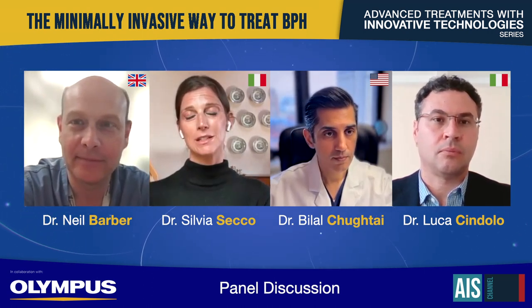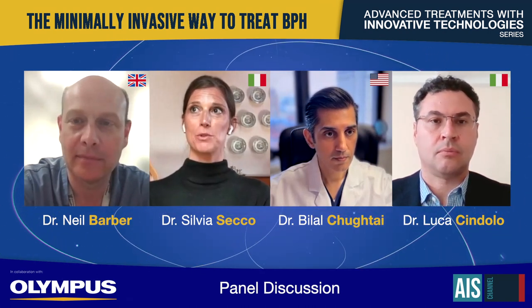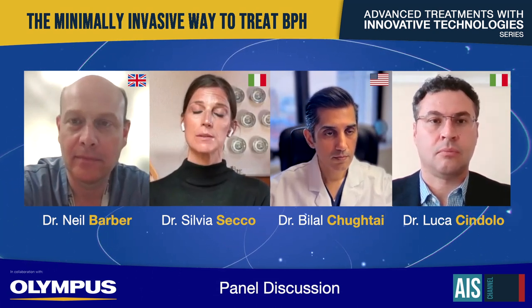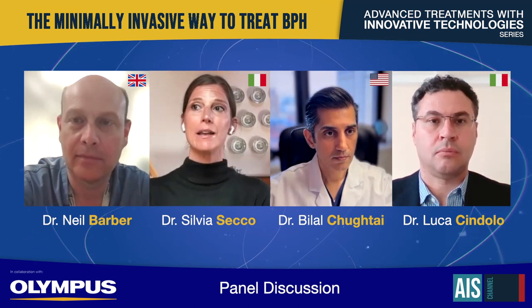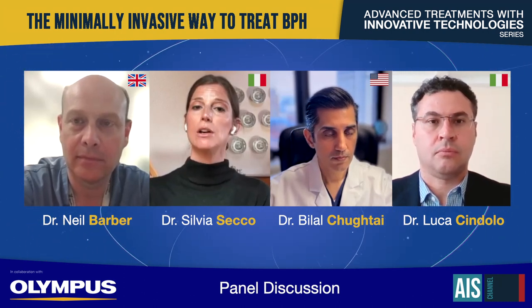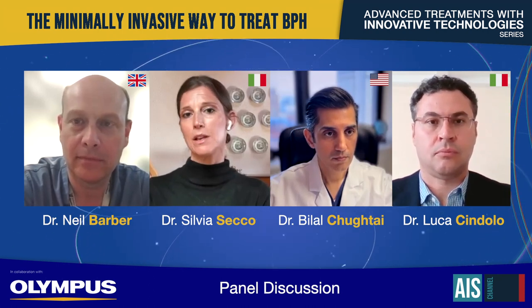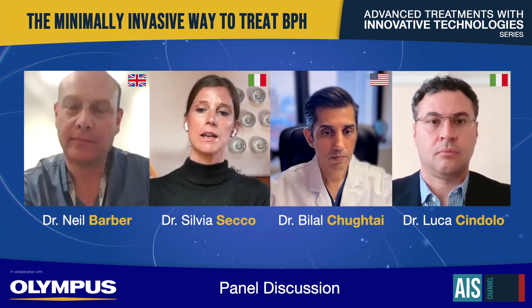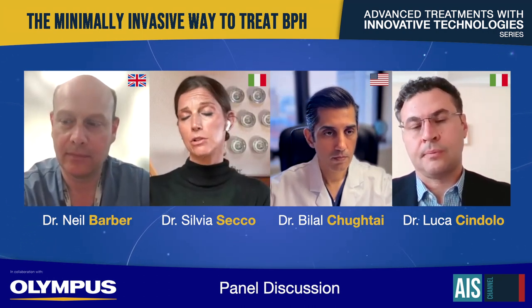Okay, actually, in Italy, there's a problem of reimbursement of these kind of procedures. So to balance the cost of the devices and the reimbursement, I perform the procedure in a day surgery. Okay, so in one day, I don't keep the patients asleep. I perform both the flexible treatment and the rigid one in local anesthesia. I don't have an anesthesiologist with me, as I've previously mentioned during my presentation. I only have a nurse, so I have to eventually add some benzodiazepine and narcotics to the patients.